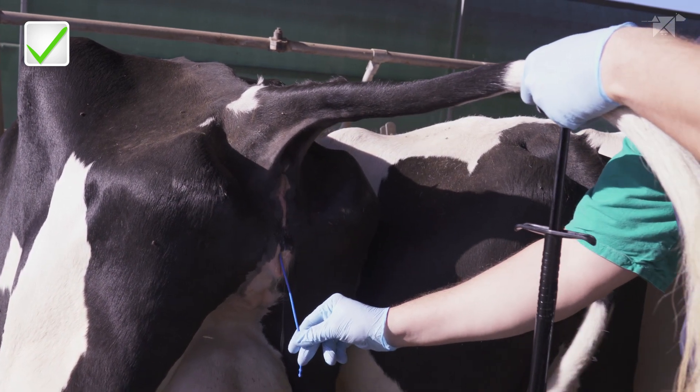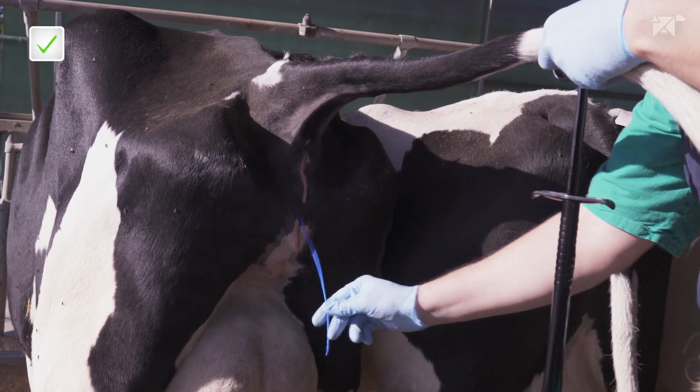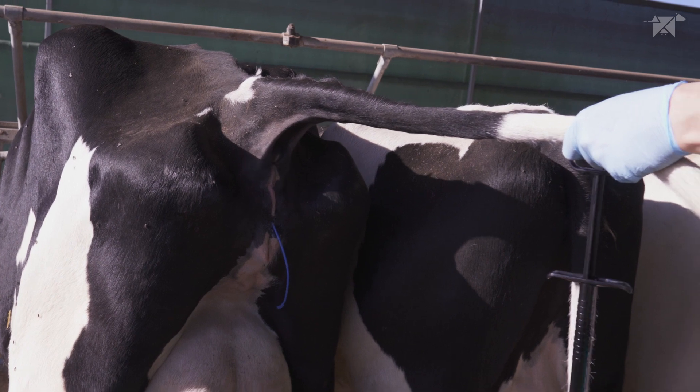Ensure that the tail of the device is looking downwards. We have ensured correct retention.